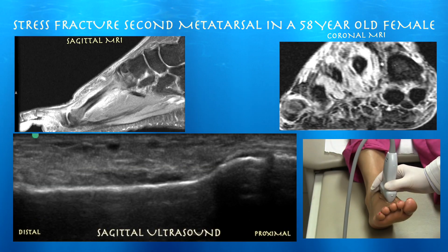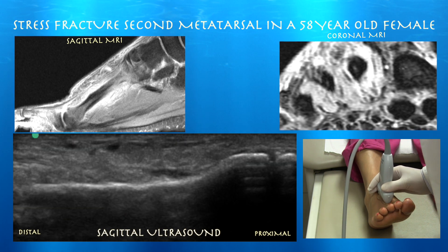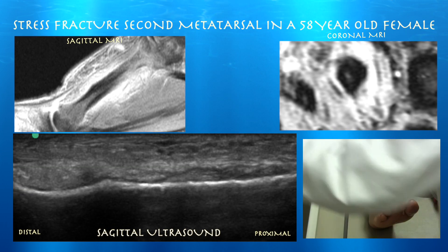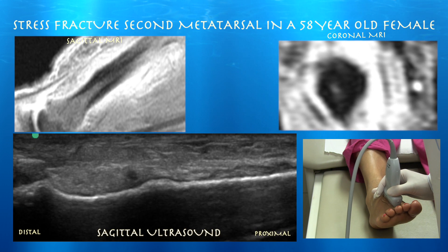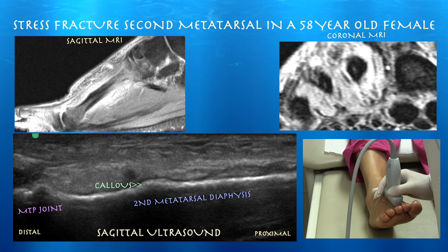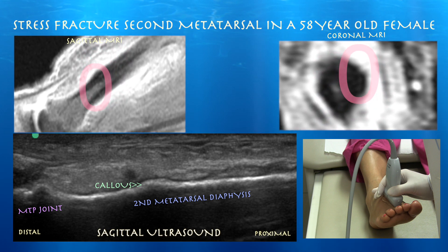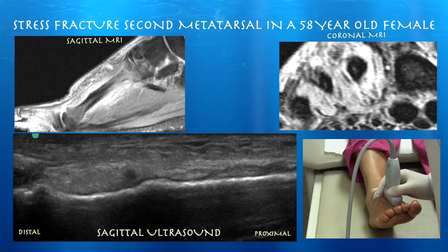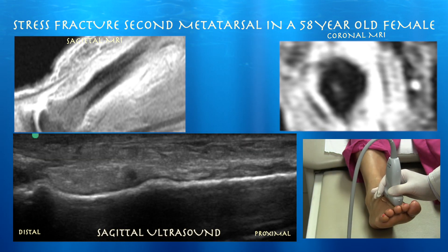Here's our first clip. We're just looking at the second metatarsal — the right side of the screen is proximal. We're following that cortex down looking for any subtle step-off. Here you don't see a step-off because she is well into this injury, but you do see a nice smooth callus formation over the fracture site on ultrasound. You don't see this finding on x-ray. You can see a little bump here, and that's where her callus formation is from the healing stress fracture.